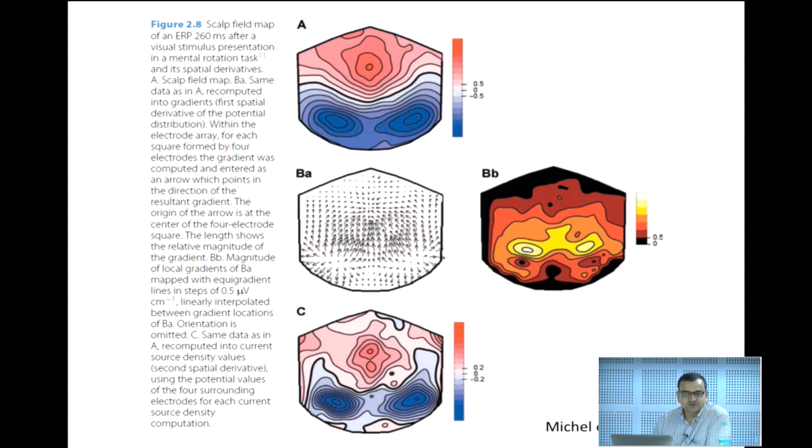You do not want to claim connectivity based on this, because it would negate your earlier finding. So in order to discriminate, you apply a current source density transformation on your data and then repeat your connectivity analysis. Whatever connectivity or strength of synchronization you get then would eliminate the possibility of a contribution from a common source.